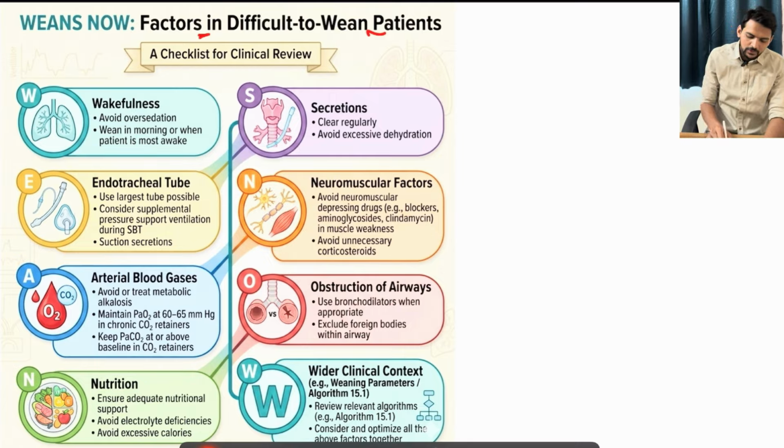So for this, we can utilize one acronym called as WEANS NOW. So according to the letters, remember few points when you face difficulty in weaning an individual from mechanical ventilation. W stands for wakefulness. We have to avoid over sedation and try to wean in the morning hours where patient will be most awake. E stands for endotracheal tube related things.